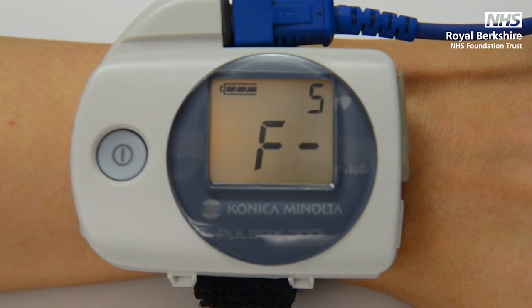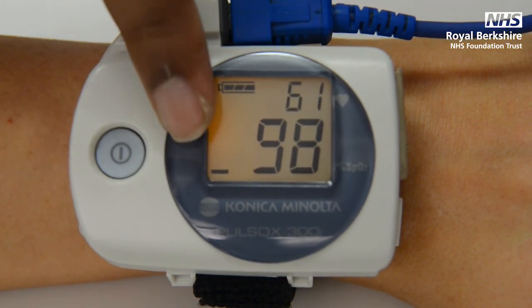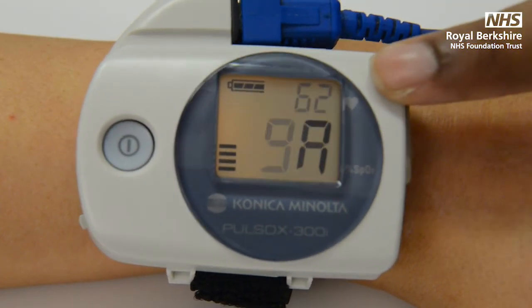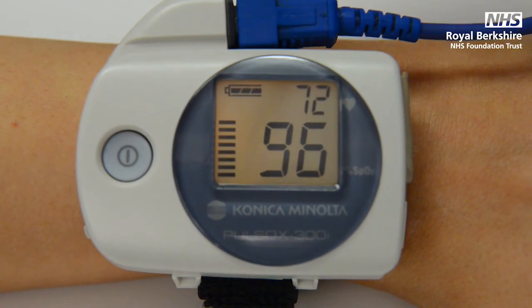The bar in the corner should be moving up and down, which represents the signal strength. After one minute, if the screen is flashing with a letter instead of the numbers, it shows the signal strength is low. If this happens, try warming up the hands to ensure good circulation to the fingers, or try placing the probe on a different finger instead.